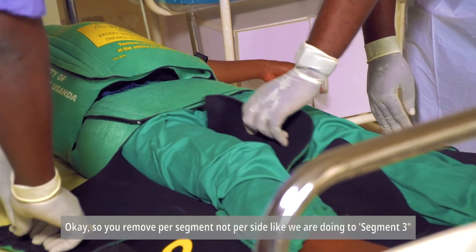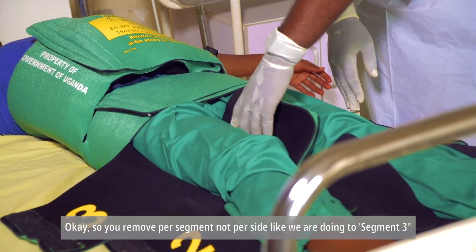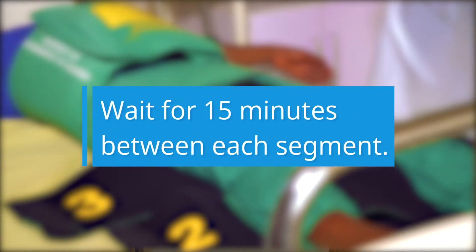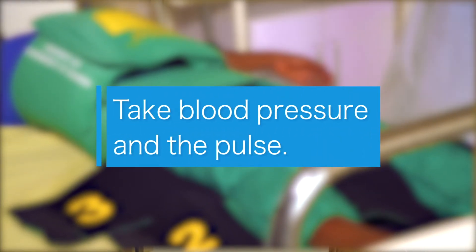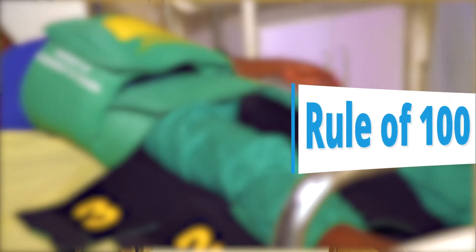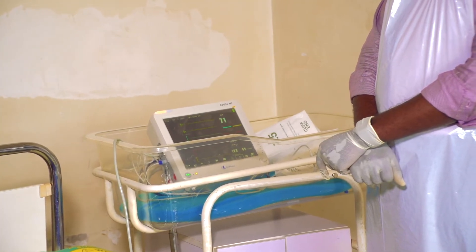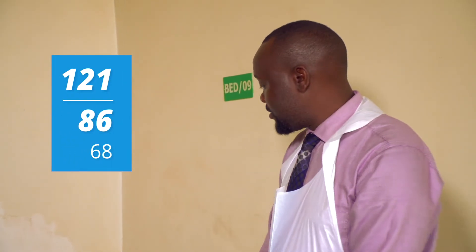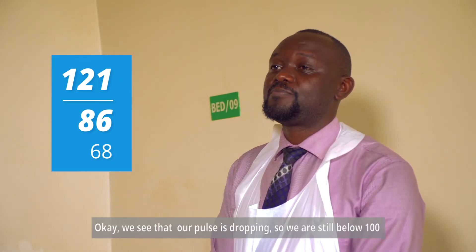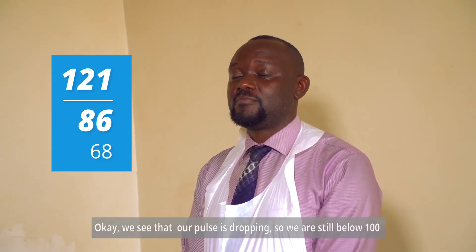We remove per segment, not per side. We remove segment three, wait 15 minutes again, then take our blood pressure and pulse — we're using the Rule of 100. Blood pressure is 121 over 86, pulse rate is 68. Our pulse is dropping to 68, which is still below 100, so we are stable.